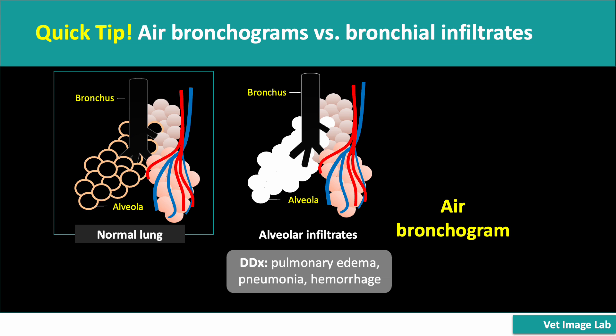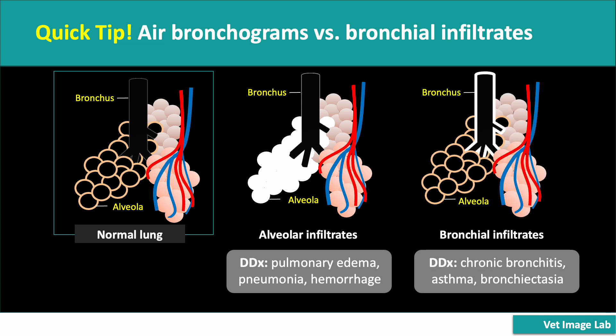The key here is that only the alveolar spaces are filled with fluid or cells, while the bronchi remain open. This allows us to clearly see these dark air-filled bronchi within the bright infiltrated lung field, a hallmark sign of alveolar infiltrates. In bronchial infiltrates, the bronchial walls become visible on X-rays due to fluid accumulation or thickening. Normally too thin to be seen, when inflamed or thickened they appear as white, well-defined lines surrounding the airway — the characteristic tramline or ring-like appearance — unlike alveolar infiltrates where air bronchograms stand out against a bright lung background. Bronchial infiltrates make the airway walls more prominent while keeping the airway itself dark due to the air inside. This distinction is key when differentiating between bronchial and alveolar patterns on radiographs.